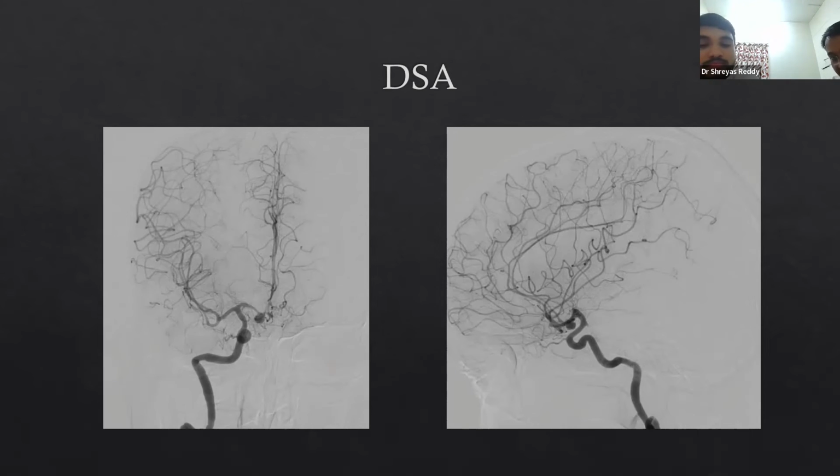So what are the treatment options available for this? We will likely coil this. Two options: surgical as well as endovascular. So what would you do for this patient? If endovascular is the treatment of choice, coiling, and also relieve the vasospasm with vasodilatation. We will not go too much deeper into this discussion.